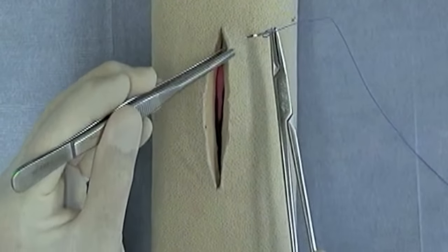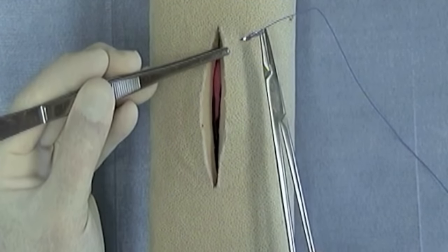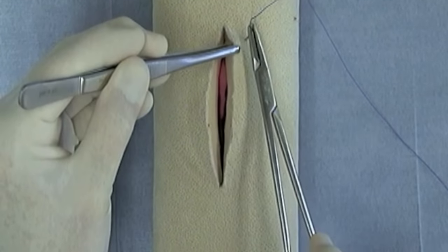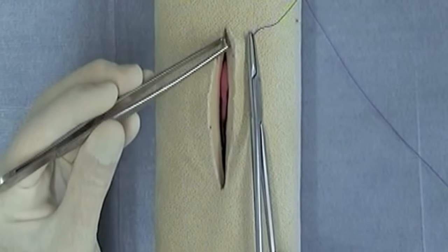You grasp the skin edge and you're taking a bite back or far from the skin edge. It's a full thickness bite through skin into the subcutaneous tissues.